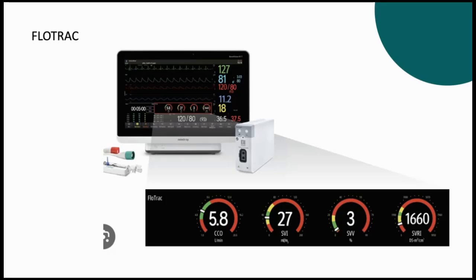And stroke volume variation, if it is more than 15%, again, is a feature of an under-volume state, and you can fill your patient and see the volume response. So likewise, we'll use this. Now it is available since it is there at Theatre 3, right?